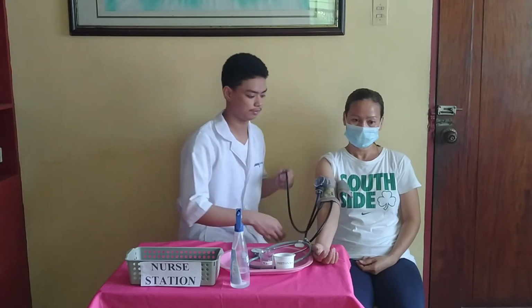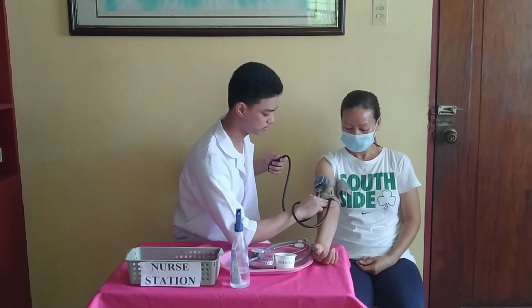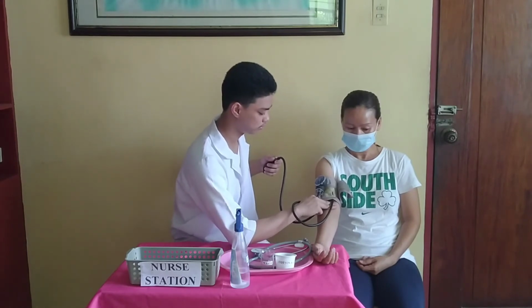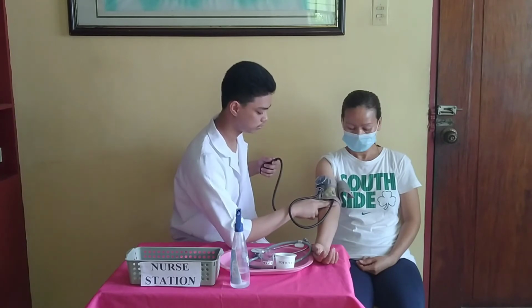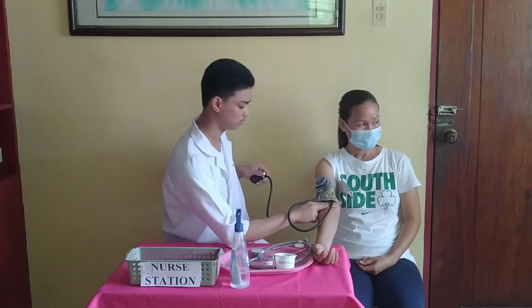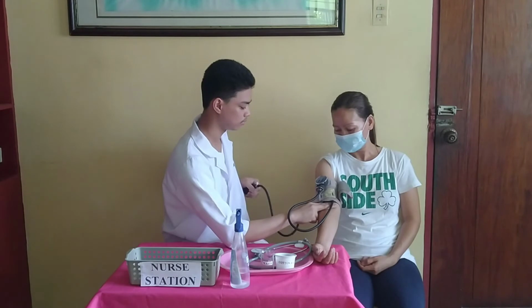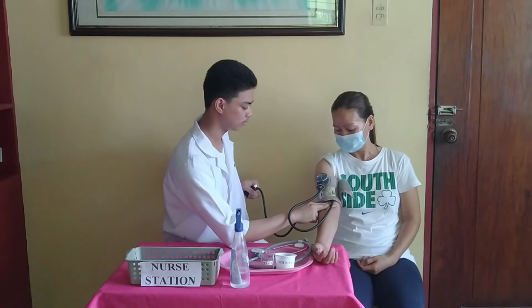Then perform a preliminary palpatory for determination of the systolic pressure of the client. For the preliminary palpatory, palpate the brachial artery with the fingertips. Close the valve of the pump by turning the knob clockwise. Pump the cuff until you no longer feel the brachial pulse. At this pressure, the blood cannot flow through the artery. Note the pressure on the sphygmomanometer at which the pulse is no longer felt. Release the pressure completely in the cuff and wait for 1 to 2 minutes before making further measurements.